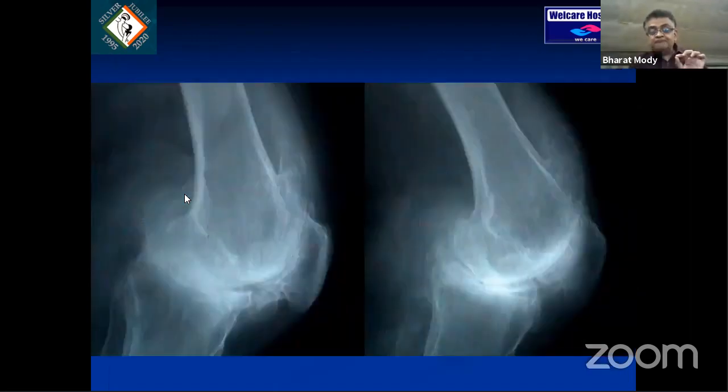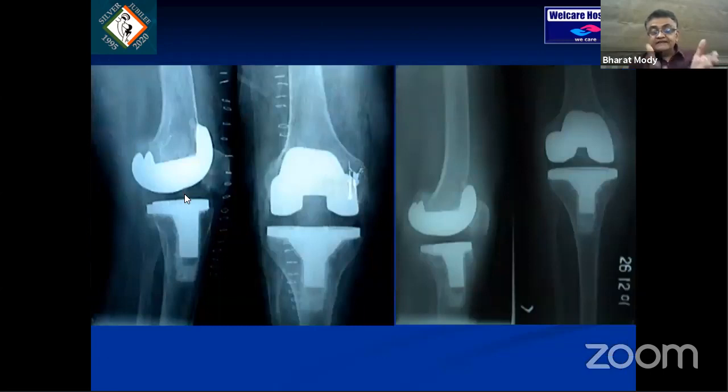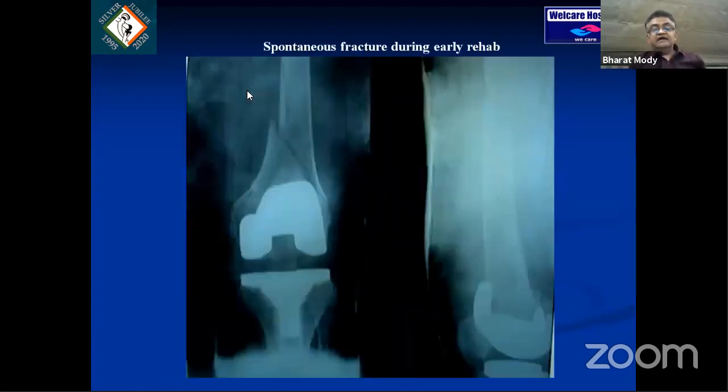In other words, this was a lateral view. When I finished my surgical action here, it all looks good. But what I realized later on was that there was still tension on this lateral side. The iliotibial band was extremely tense. It was a bilateral knee case. In those days, I used to keep patients for 10 days. I did not operate in quick succession. I would do the second knee only after I was happy with the first knee not running into any trouble.